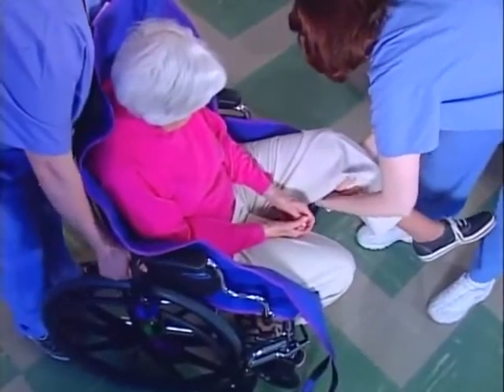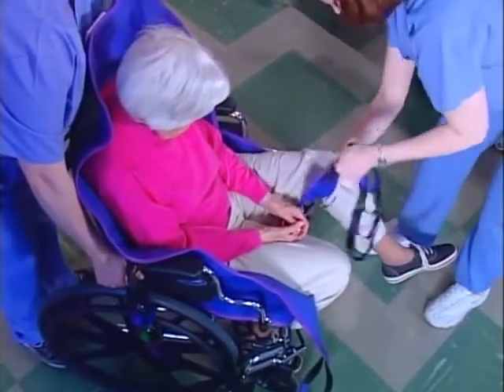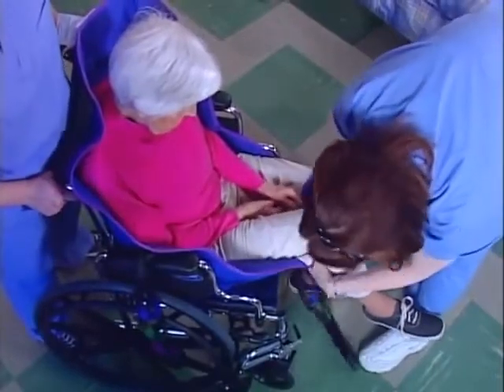Lift one of the resident's legs. Reach under and pull the sling out until it's just behind the resident's knee, about 3 inches. Repeat the procedure for the other leg.